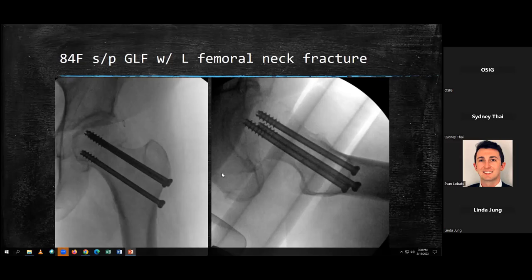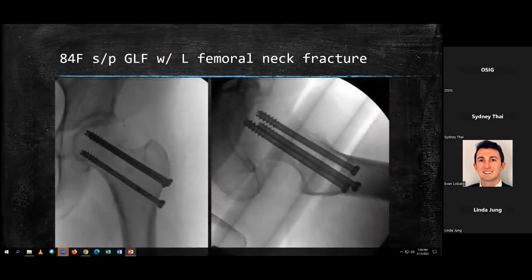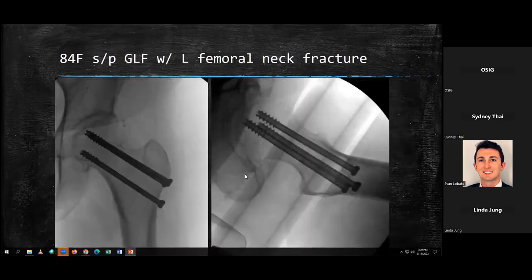The way that you shoot it in the OR is sort of from here. You get a lateral of the hip, and then you're looking at it and you see the 3 screws that way. And it's the post-op. Why do they? Oh, you mean there are not a lot of threads, right? So screws, we think of having threads all the way across. So what would be the point of having screws with only 7 threads? Yeah, cheap, right? Fully threaded screws are expensive. In fact, these are more expensive.